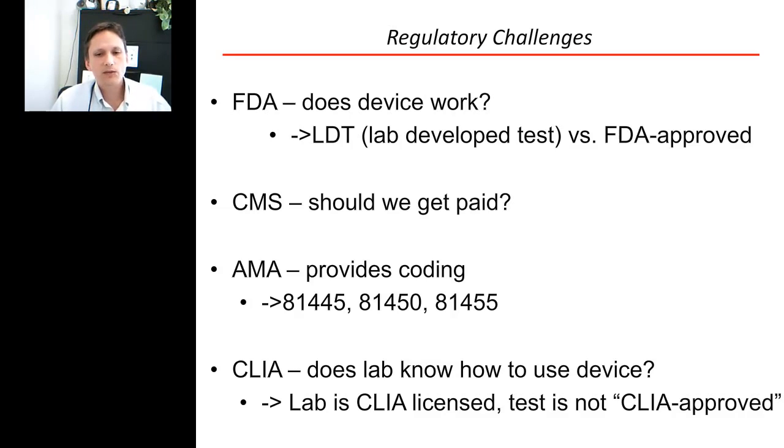So the space we're working in for now, obviously some of the big players, including Illumina, Life, Archer, QIAGEN, are going to be very interested and are very interested in proceeding down the road of getting FDA approval, and that we'll see in a few years.